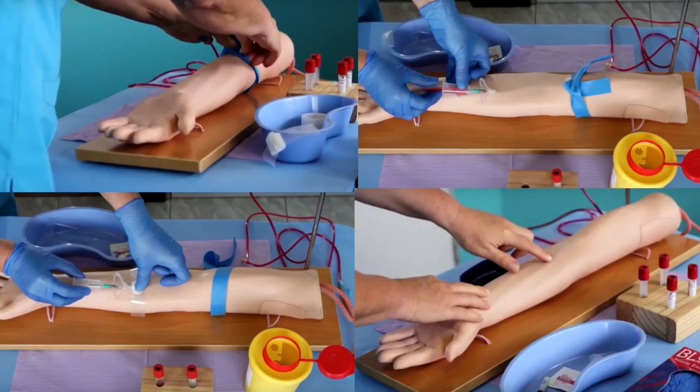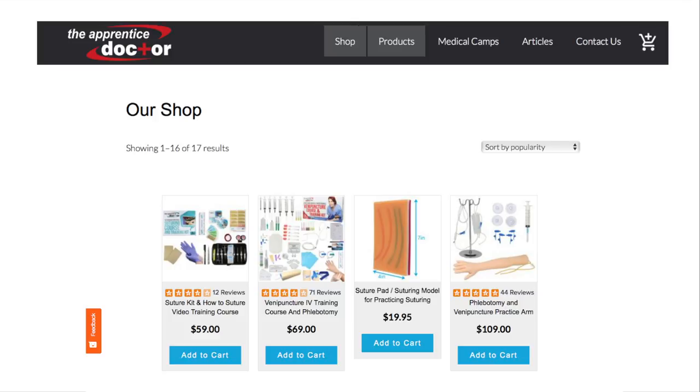Allow the arm a disuse period of 2 to 3 weeks before using it again to allow the latex tubes to reseal. Hint 5: After extensive use, like all phlebotomy training arms, the arm will start leaking. The Apprentice Doctor phlebotomy arms are favorably priced, thus replacement skins and tubes are not supplied. We recommend replacing the old arm with a new one.